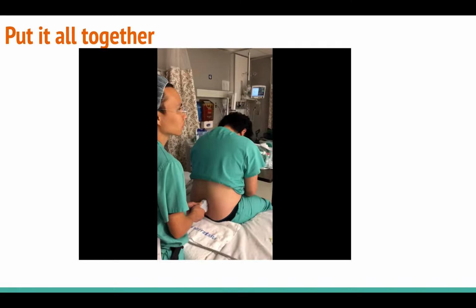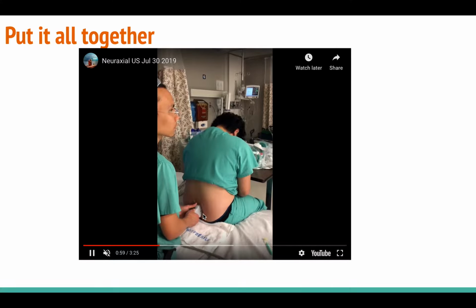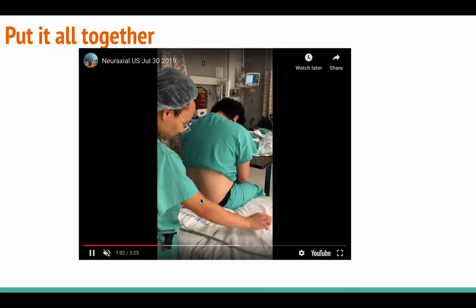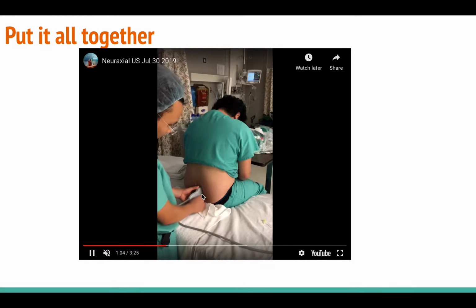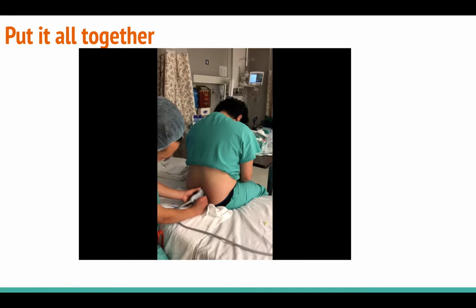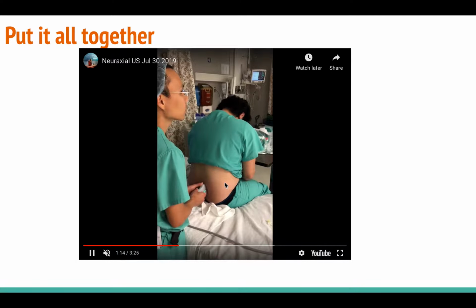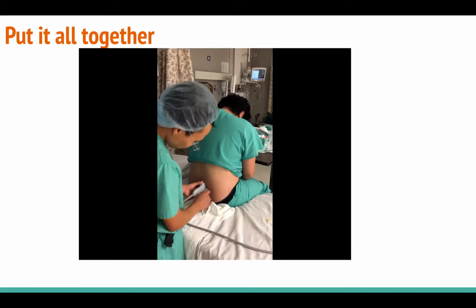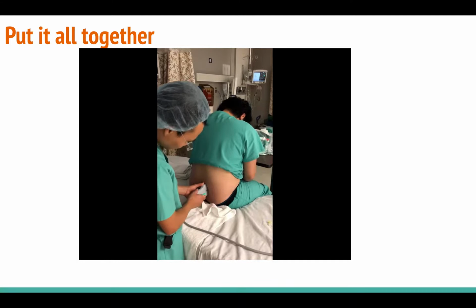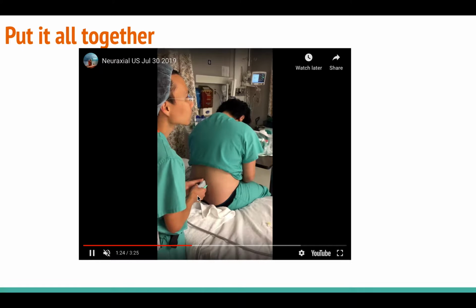So maintain the same parasagittal oblique view, but slide downward. Try to find my L5-S1 interspace. Line it up in the middle so it matches up with the middle line of my transducer, and mark it. So this will be my L5-S1 interspace, and then keep sliding up and repeat the same process. Identify my L4-L5 interspace, and then next will be my L3-L4 interspace.